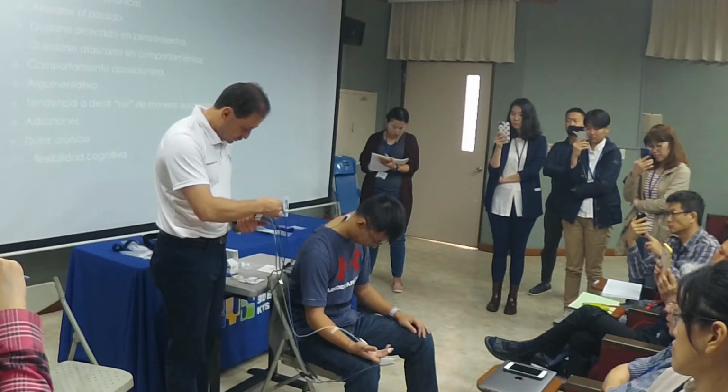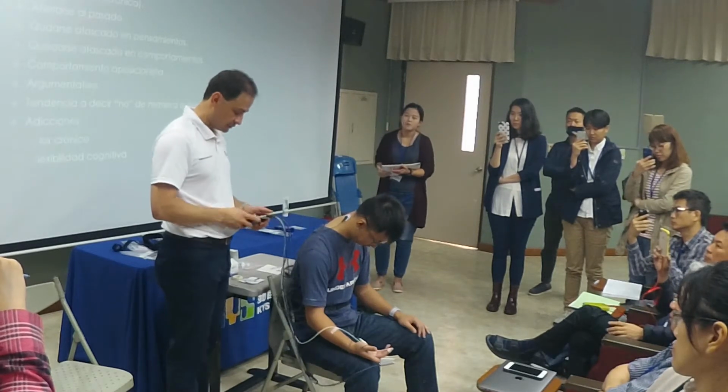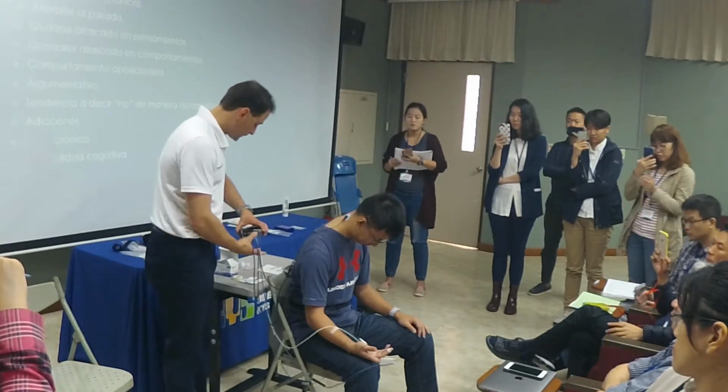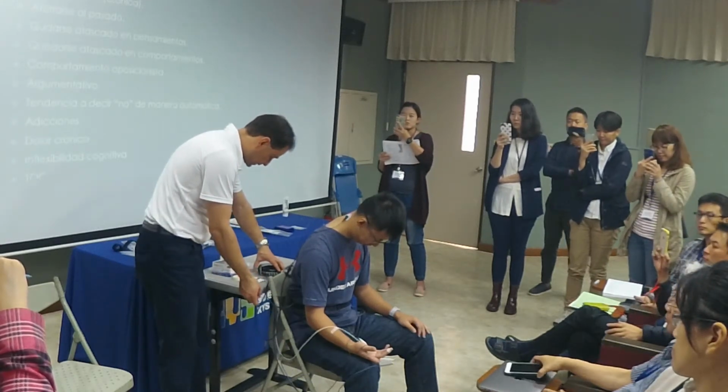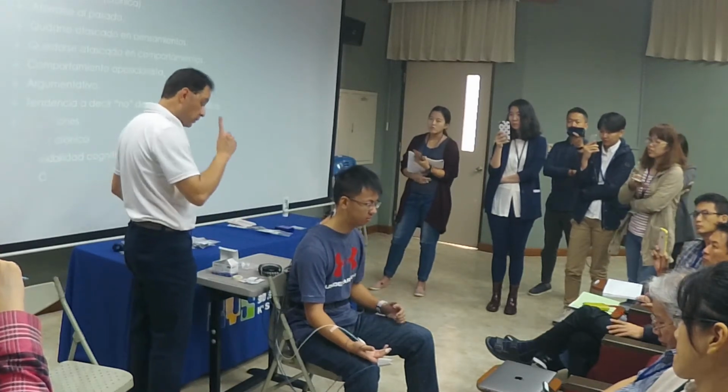I'm going to go with the EMG, and same thing, we match the red dot with the red dot, and there we go. Good. And we need one more, which is our ground cable.